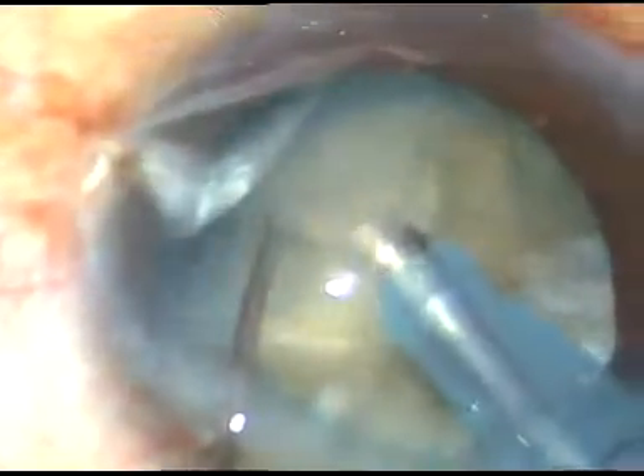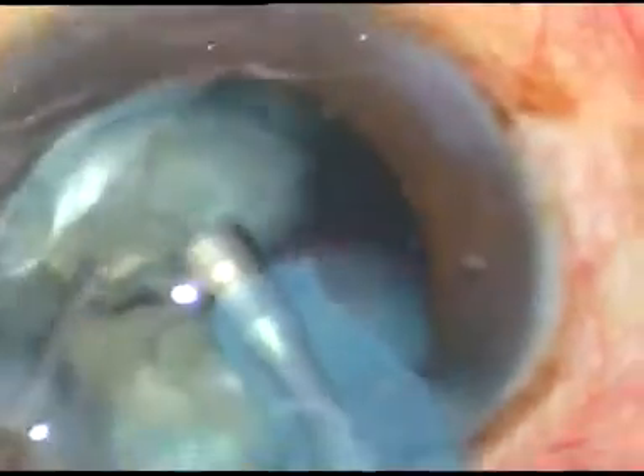This is actually vertical chop. Now I am holding the nucleus and very close to the tip I use the chopper. The nucleus has been divided into four parts. Each part is drawn to the center of the anterior chamber at the iris plane, and it is emulsified and removed. Phaco power used in this case is 65%, flow rate is 45 ml per minute, and vacuum is 450 mmHg.